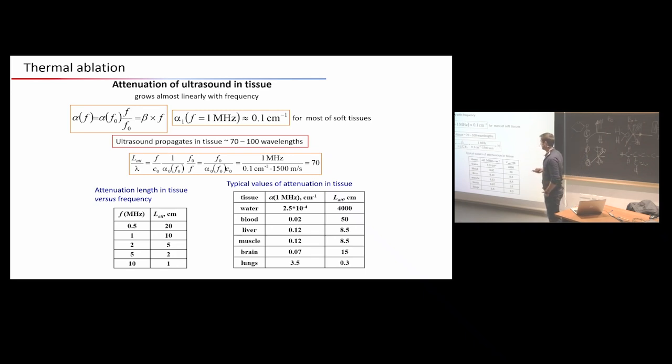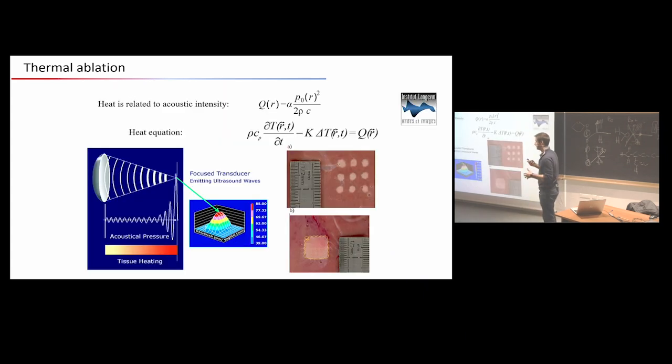Another very important thing is that the ultrasound absorption depends on the frequency you are using. If you are using a very high frequency, like the frequency for imaging, your tissue will absorb this energy much more easily than at low frequency. That is going to be a problem, because I said at the beginning that we transmit at very low frequency to improve the penetration. But if you transmit at low frequency, you will in fact have less thermal efficiency. Your tissue will not absorb in the same way. So it's a kind of trade-off, and you can play on the frequency for that.